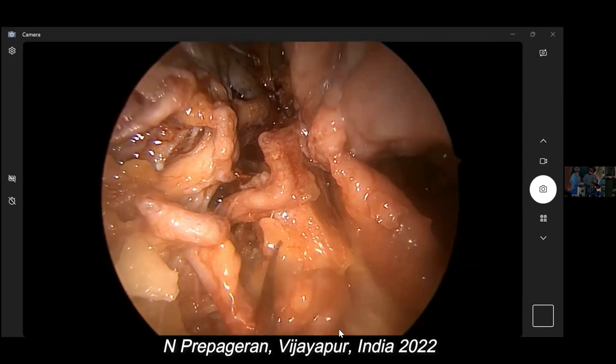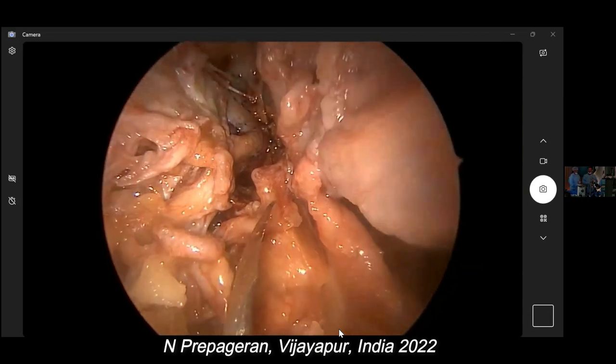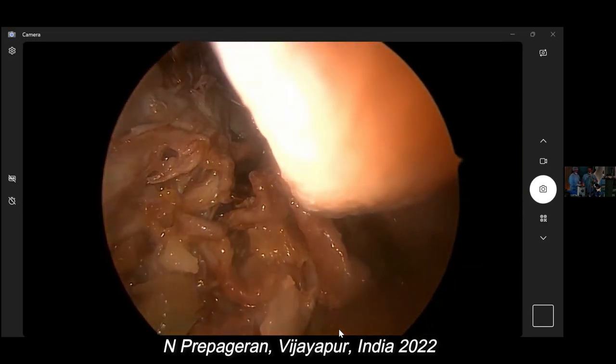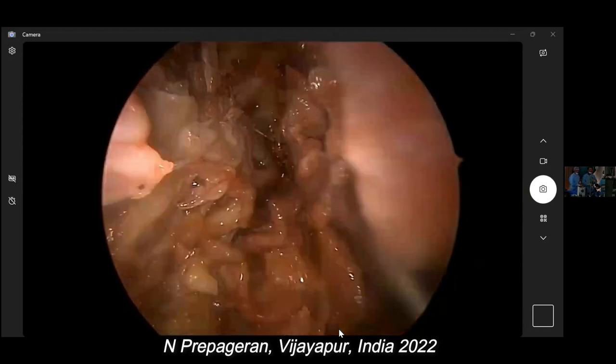Sir, in angiofibroma, till what level would you drill out, sir? You don't have to drill. Just follow the tumor. Remember I was telling you, just follow the tumor. You hold the tumor, pull, dissect around it. You don't have to drill anything. Keep life simple, guys.